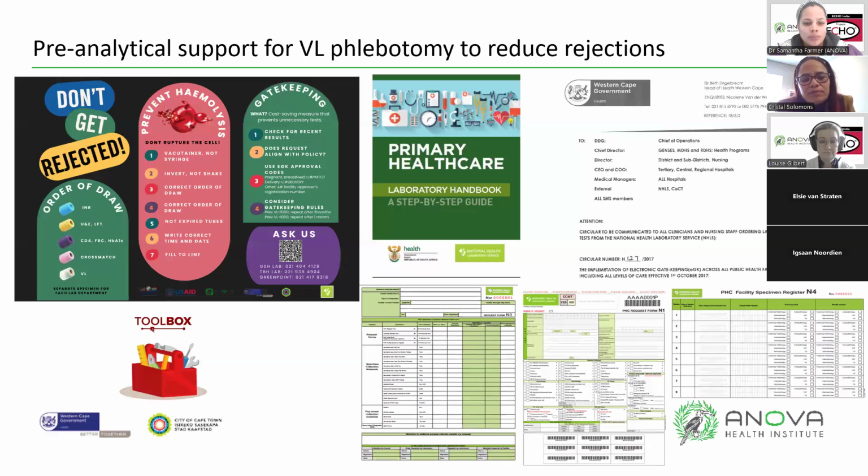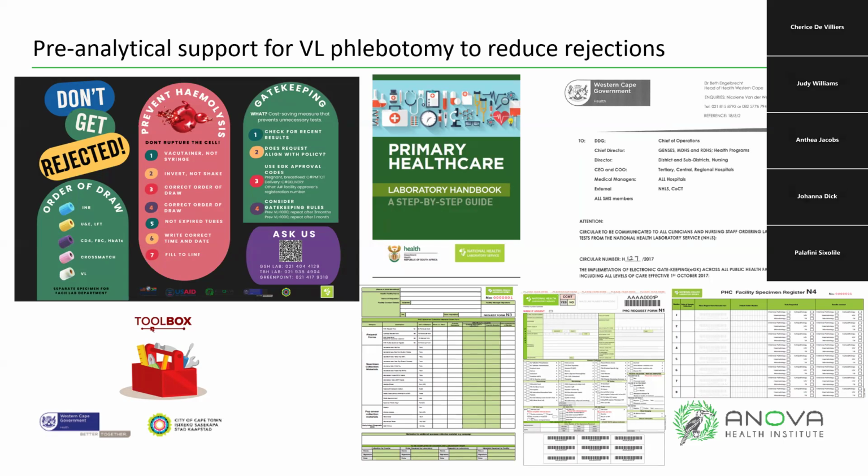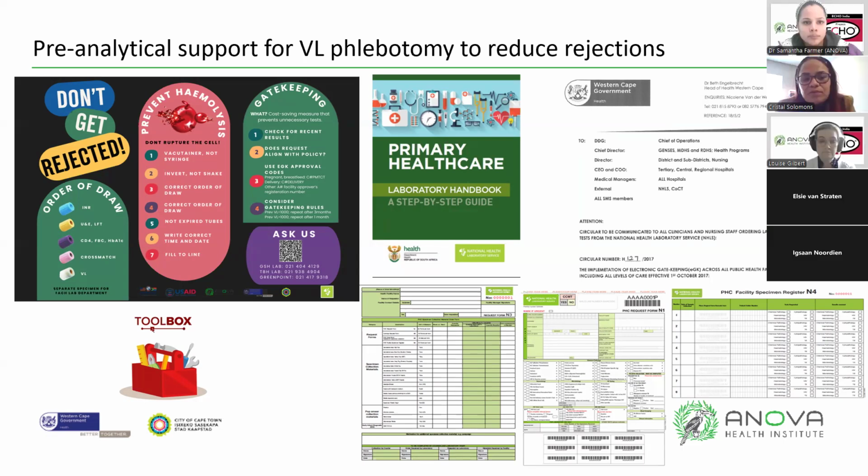And then there are other tools that are quite important when we look at reducing rejections, because the primary healthcare lab handbook is basically a step-by-step guide. It will take you right from how to collect, what bloods to take, how to store samples, right up until when the courier comes to collect, and up until the completion of the forms. So it's really a good guide, and every blood room should essentially have a PHC lab handbook, because it's really great.